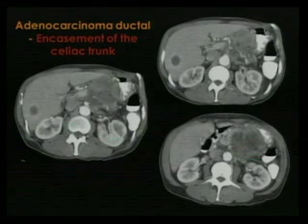Let's see some examples. Adenocarcinoma affecting the celiac trunk. We have a big tumor affecting the pancreatic body, basically, and you can see how the celiac trunk is affected in its origin. You see how narrow it is. If you compare, this is part of the hepatic artery, look at the density of the hepatic artery, look at the proximal celiac axis, we have heterogeneity, and this is due to involvement of the lumen. Same situation for the splenic artery.